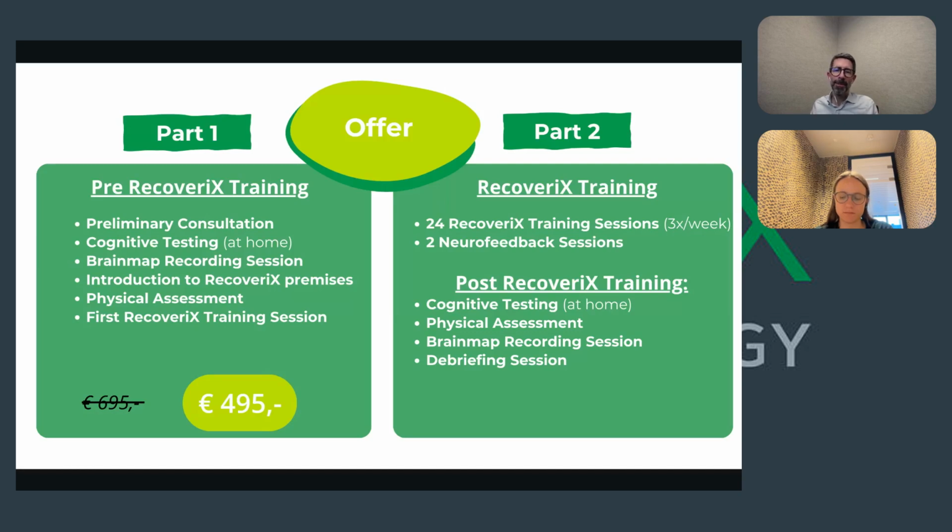And after those 26 sessions, we have come to the end of the recoveriX training, and we'll do cognitive testing, the physical assessment in house, and also do a new brain map, so that we have all the measurements that we can then put together and say before and after, and put this out in front. By then, I think a lot of improvements in everyday life should have become very visible.